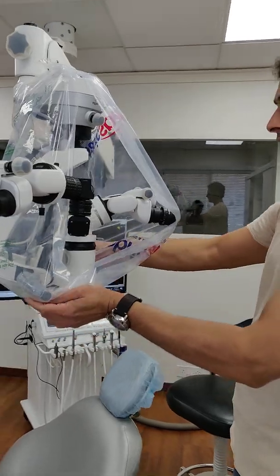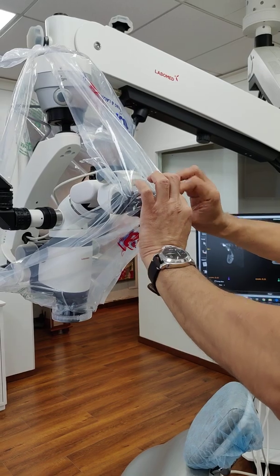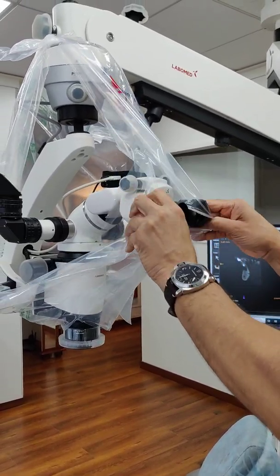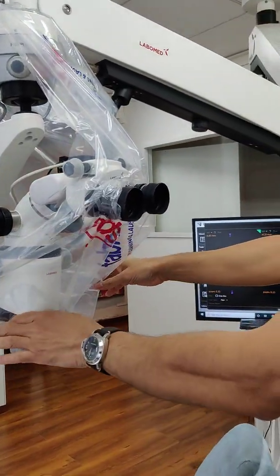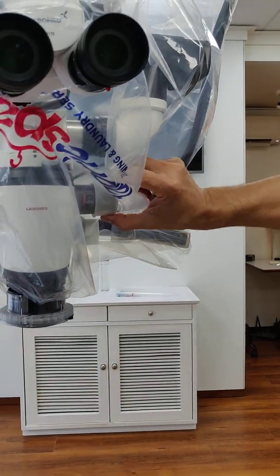Then the next thing that needs relief is the eyepiece itself. So we are going to give some relief for the eyepiece by putting a small hole there. So we give relief for the eyepiece.